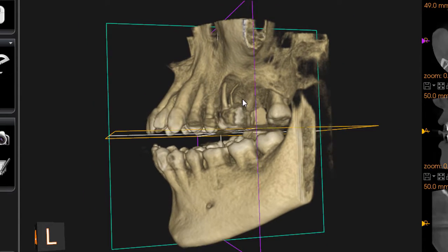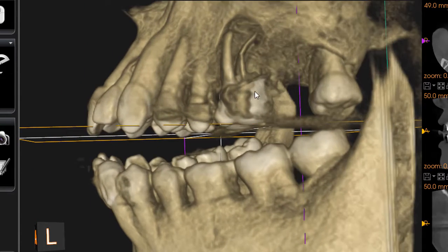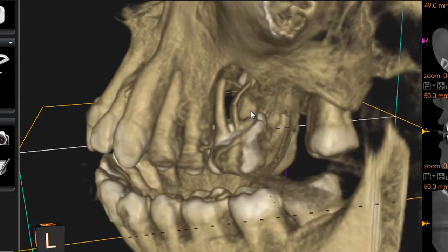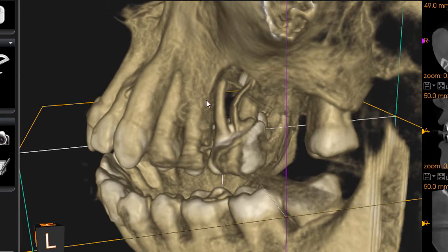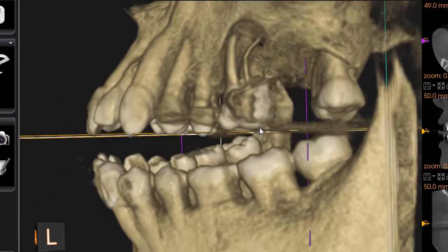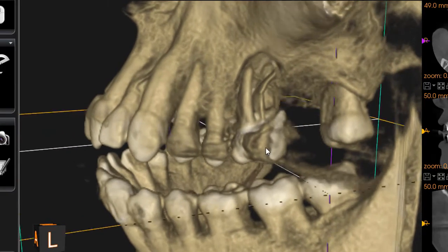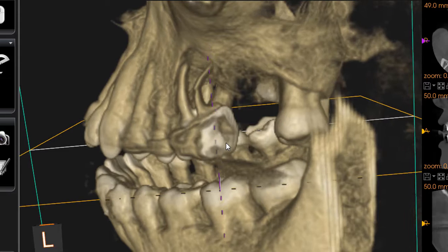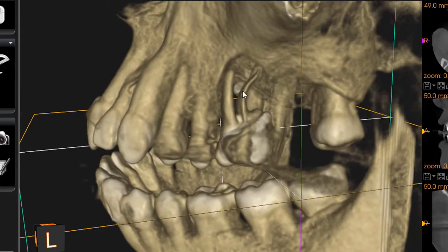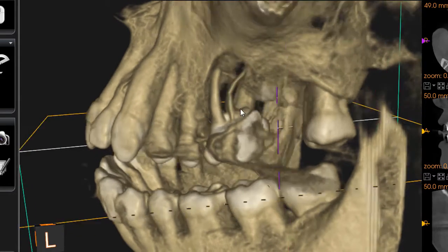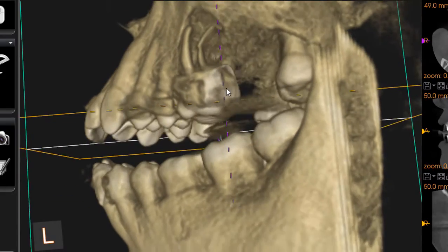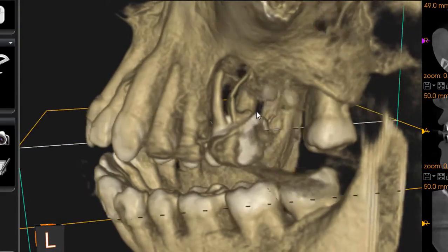I have taken a cone beam CT scan — you can see that tooth number 26 in the upper left area is having a very big defect, causing a lot of bone destruction. It affects the tooth very badly. If the patient leaves the tooth without treatment, it causes bone destruction.